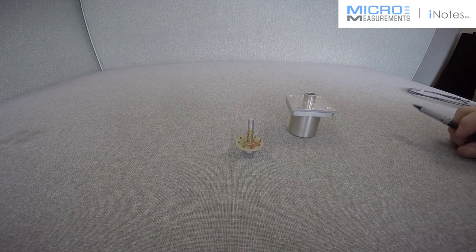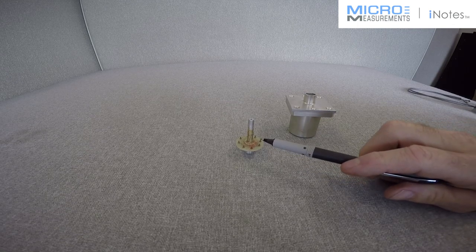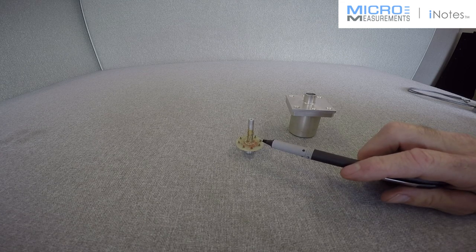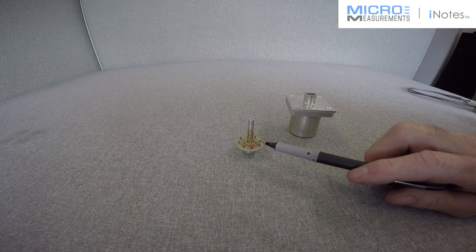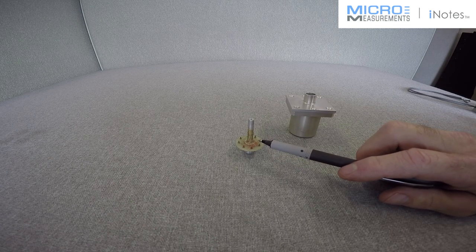A couple problems we ran into was putting eight gauges around such a small diameter left very small solder tabs which were very delicate and extremely hard to work with. There was a lot of rework in the production gauging because of the tight quarters on this.